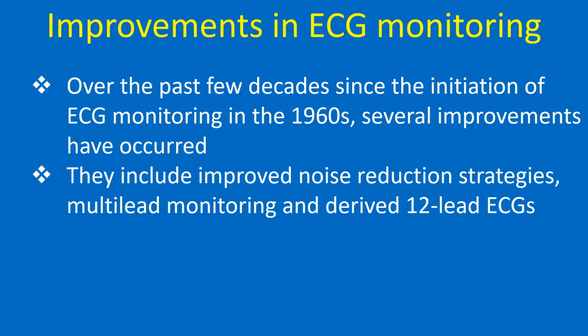Over the past few decades, since the initiation of ECG monitoring in the 1960s, several improvements have occurred. They include improved noise reduction strategies, multi-lead monitoring, and derived 12-lead ECGs.